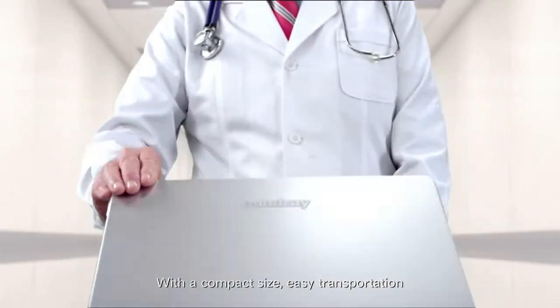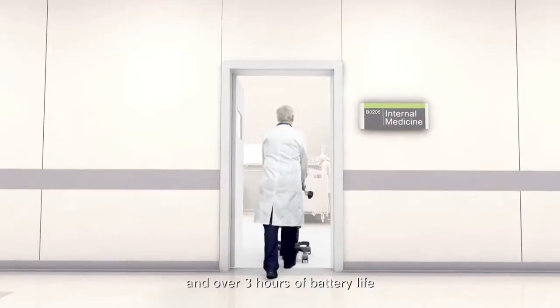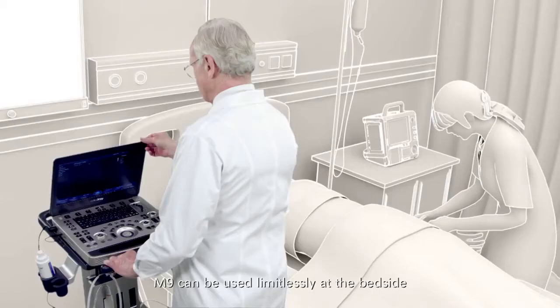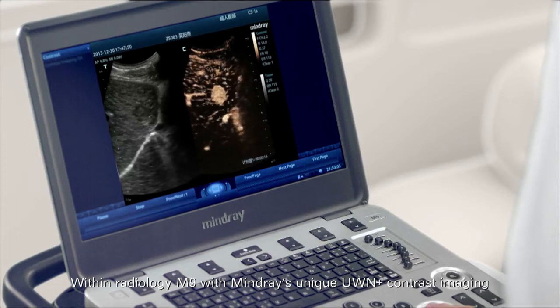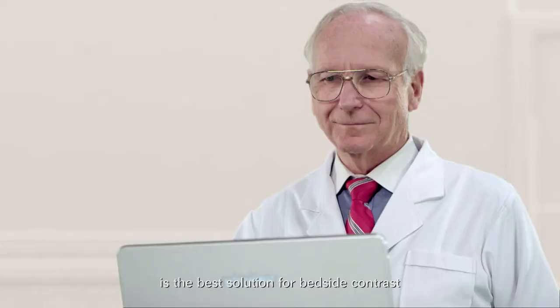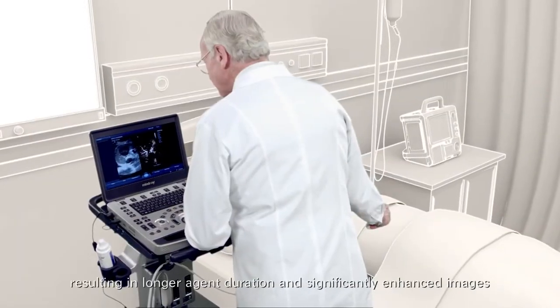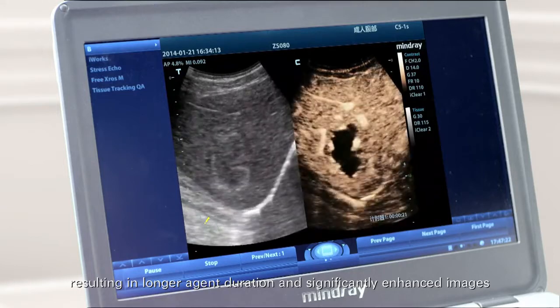With a compact size, easy transportation, and over 3 hours of battery life, M9 can be used limitlessly at the bedside. Within radiology, M9 with Mindray's unique UWN-Plus contrast imaging is the best solution for bedside contrast, resulting in longer agent duration and significantly enhanced images.